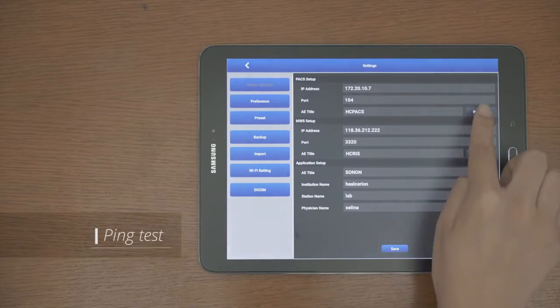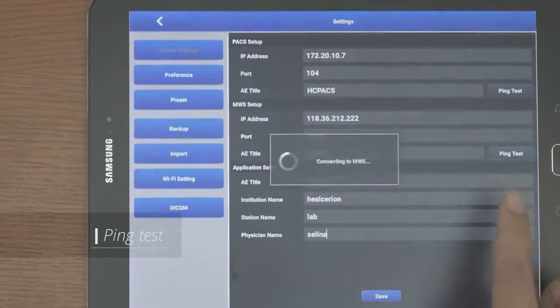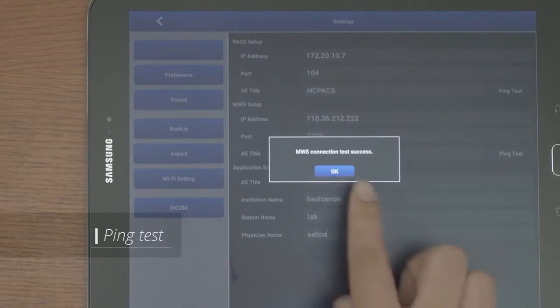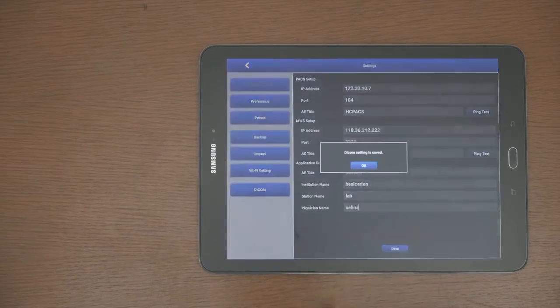And perform a ping test to confirm the connection. Once you see the success message, you can now scan.